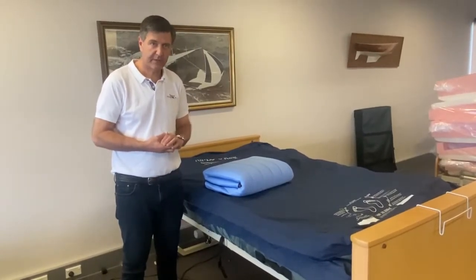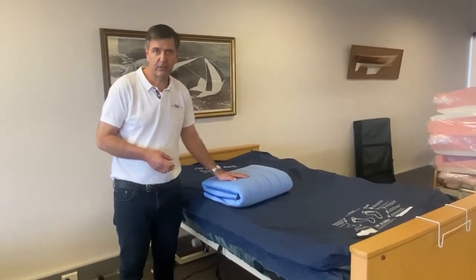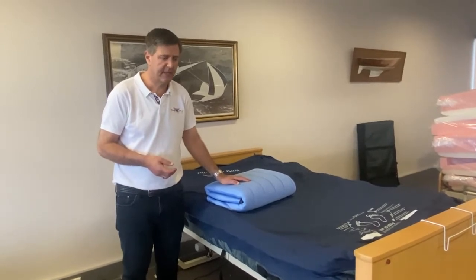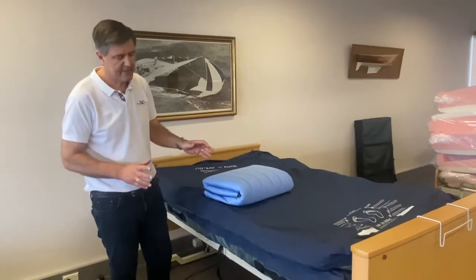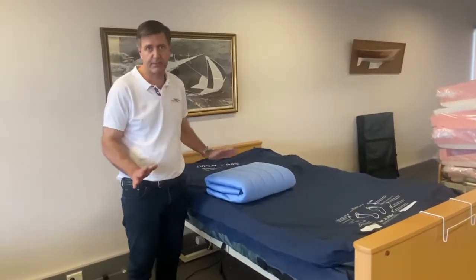This will be a quick tutorial on how to put a coverlet on a King Single Mattress Replacement, usually an AirLo8, but it could also be a TheraFlow8. For display purposes, we've got it on a bed with rather bulky bed ends, so I've put it on top of an existing fully inflated mattress just for display purposes.